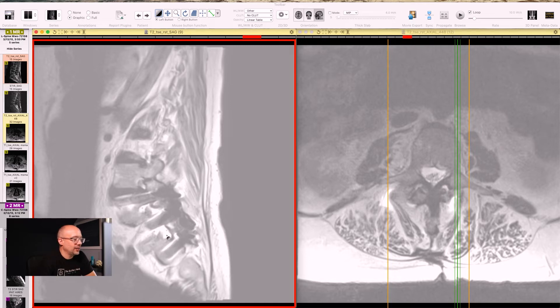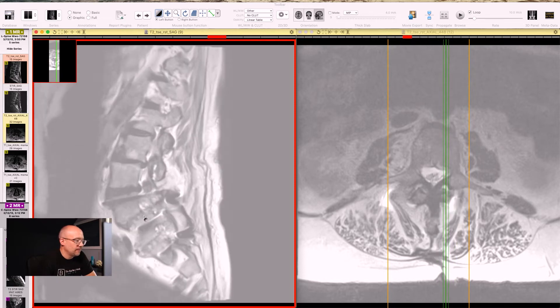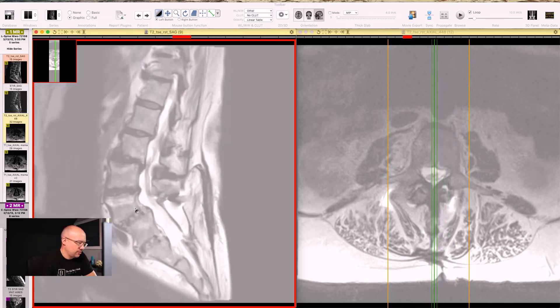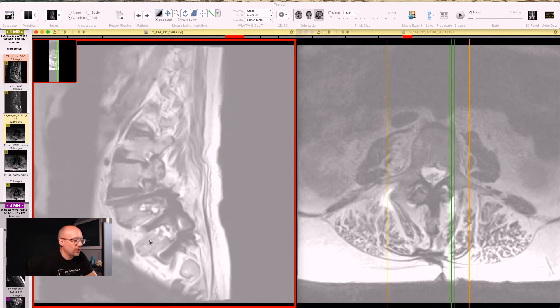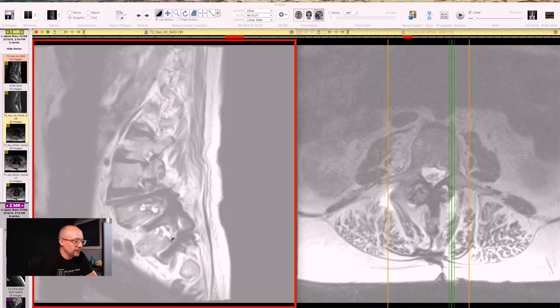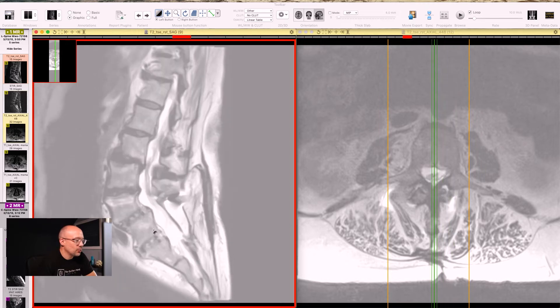That is a multi-level spinal fusion. I believe it's L4, L5, S1, multi-level spinal fusion. L4, 5, and 1 have all been fused. Look at that hardware going in. So that is why between L4, L5, that disc space right there, and between L5, S1, that disc space right there, that's why it looks so different. It's because the hardware is around.